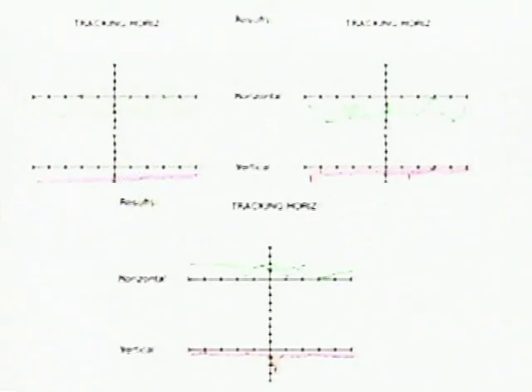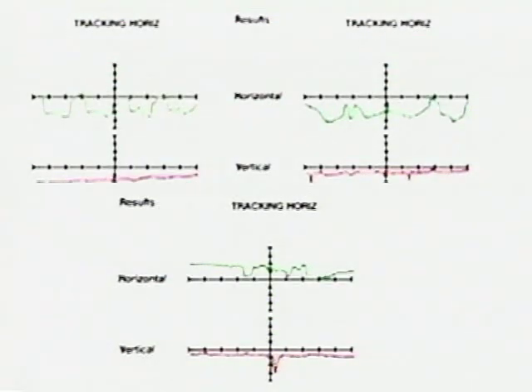The next three selections demonstrate abnormalities in undershoots where the patient's eyes are not able to rise to the top of the target and to follow the target in a smooth type pursuit. These represent also common abnormalities.